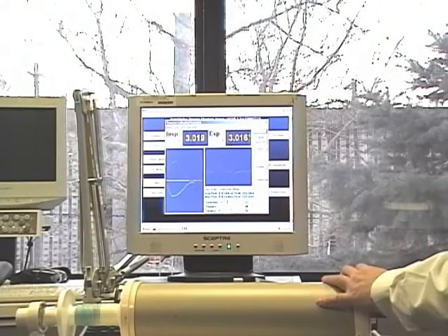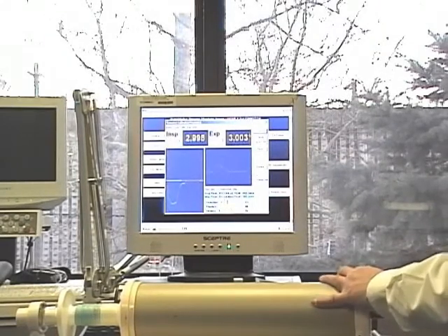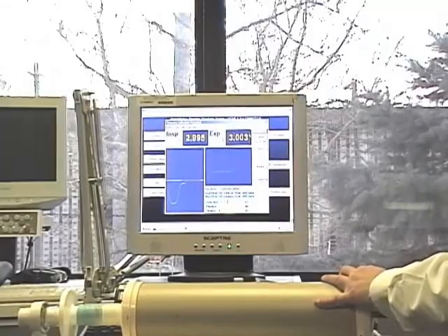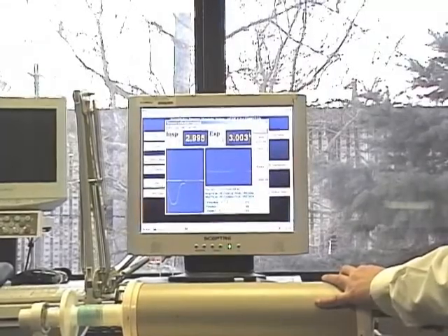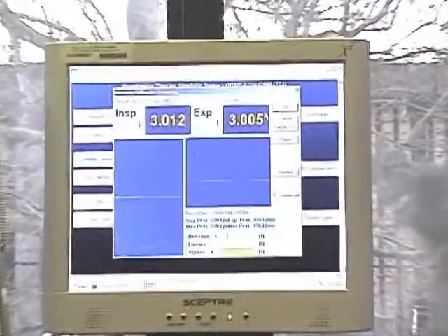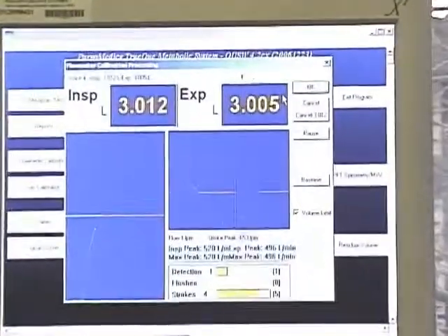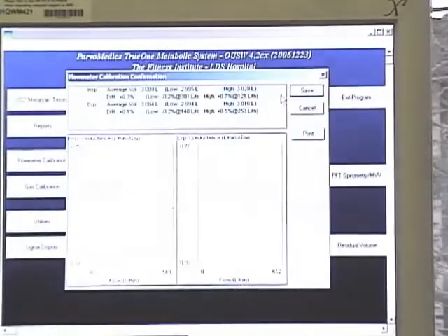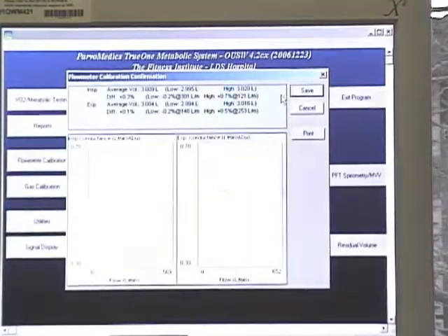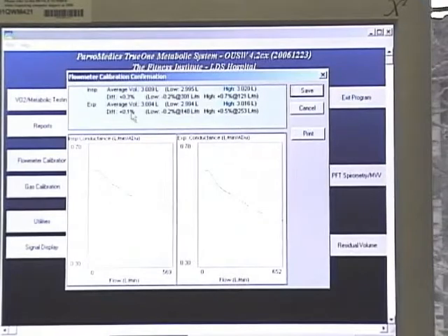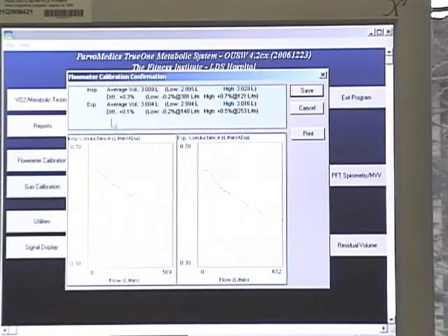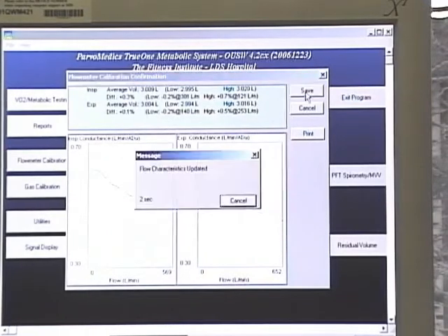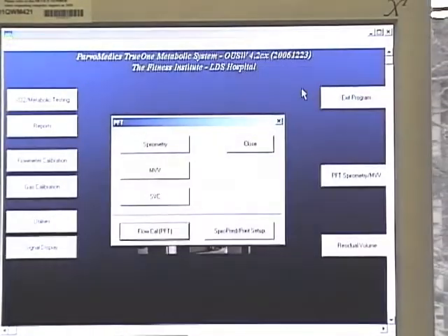And finally the last one. Then I pull to finish and push it back. The expiratory average difference is most important. Right now it's 0.1 percent, inspiratory is 0.3 percent, but you save it.